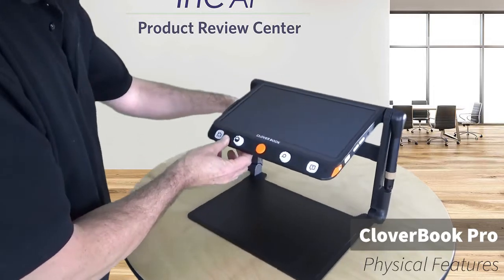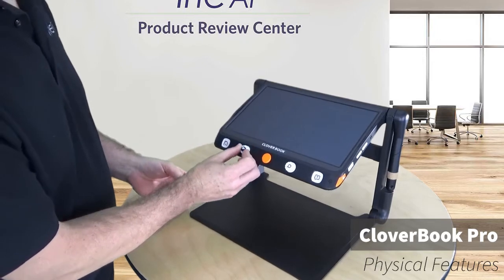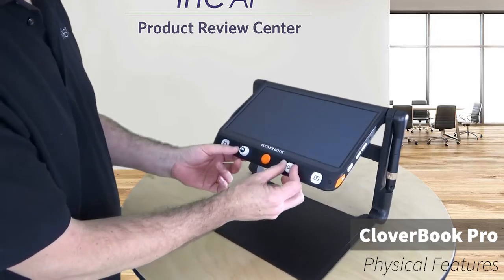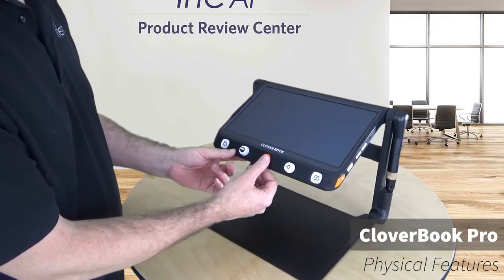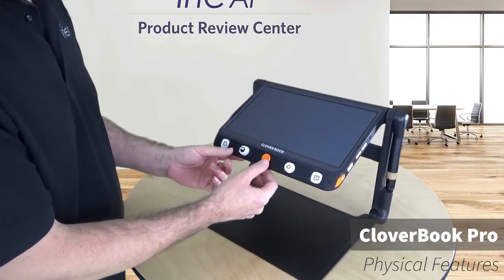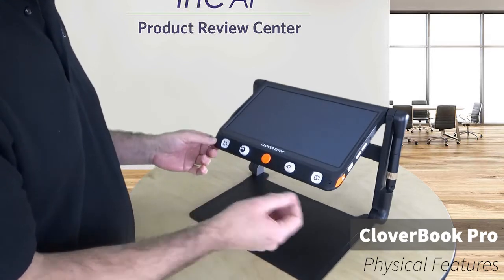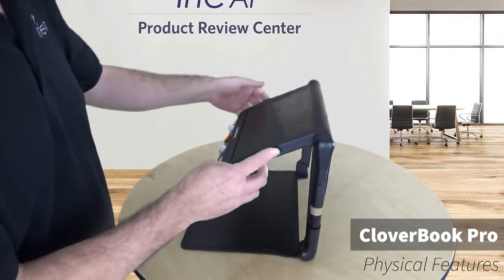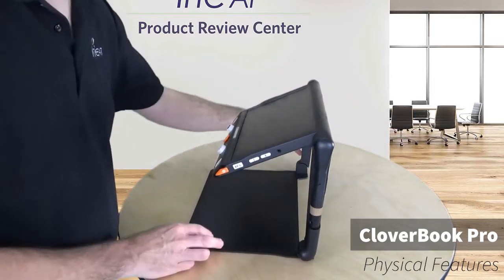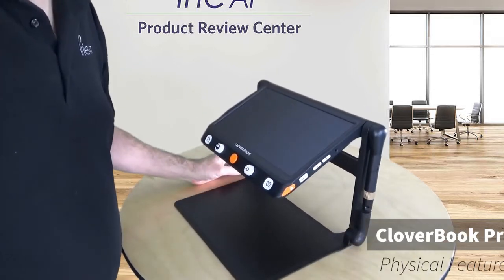Let me turn this around. I really like to point out a few things here. Again, we have wheels for controlling the contrast and the magnification. We have a joystick in the middle for live panning and frozen views. You can see everything that your camera sees without moving the material or your device. We have a text-to-speech button, as well as some others for volume and things I'll show you once we get into the operation. So let's turn this on and see how it works.